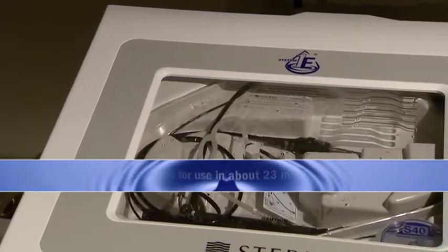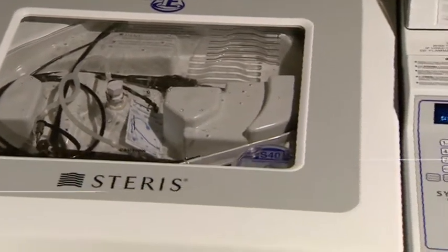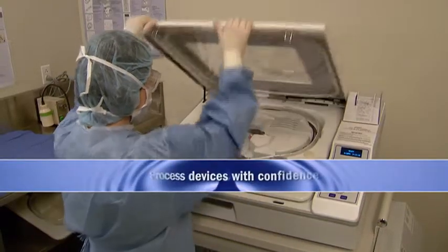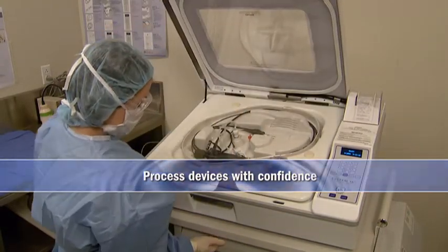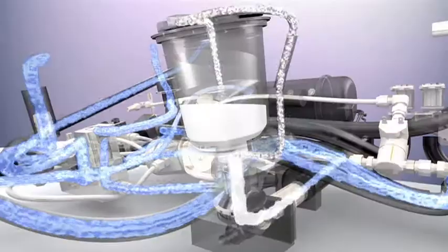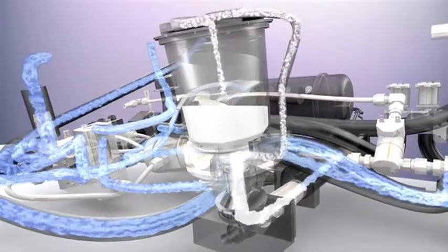With a 20% faster cycle time than System 1, devices are ready for immediate use in just 23 minutes. After following all directions and instructions for use, the operator can have complete confidence that a successful processing cycle has been achieved. Steris' high standards of validation were developed to help ensure your peace of mind.